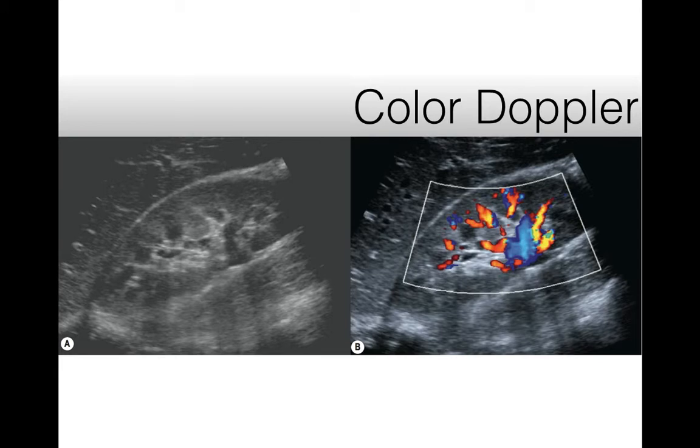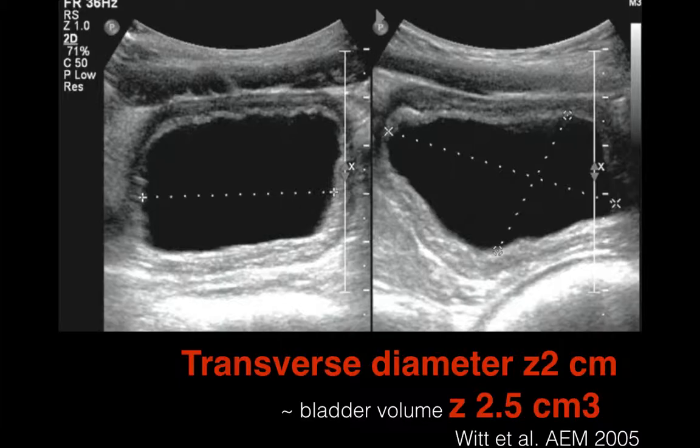In this picture, some of us will be confused about hydronephrosis. Some of you will diagnose it as mild hydronephrosis. When you have difficulty or are confused with the problem, if your machine is equipped with Doppler function, turn it on, and you can see that this kind of pelvic dilatation is due to prominent vessels instead of hydronephrosis.